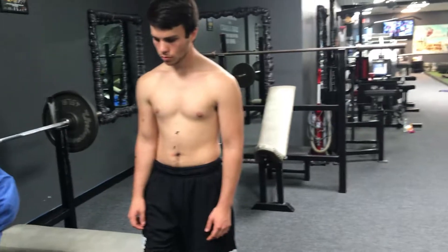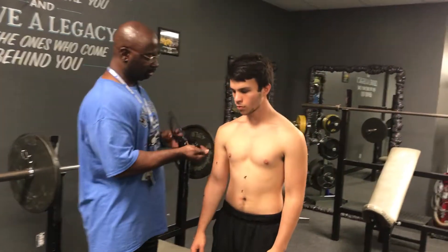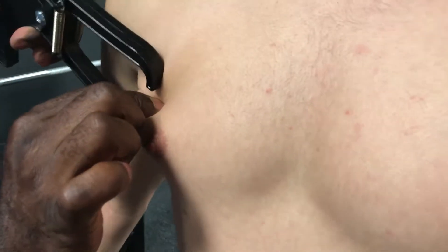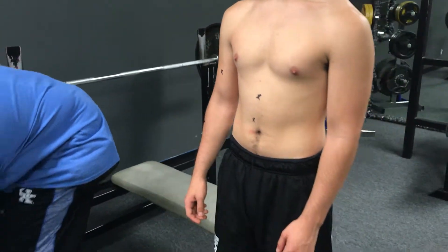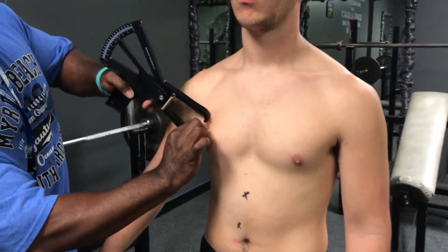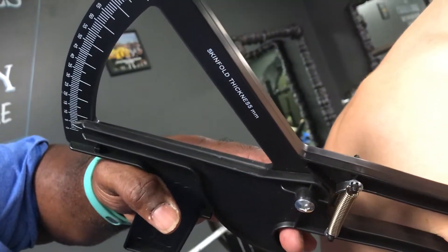Next is your chest. I'm going to measure right across the anterior axillary line at the nipple line. Come in right here. Right at 5. Let's do it again — looks like 4.